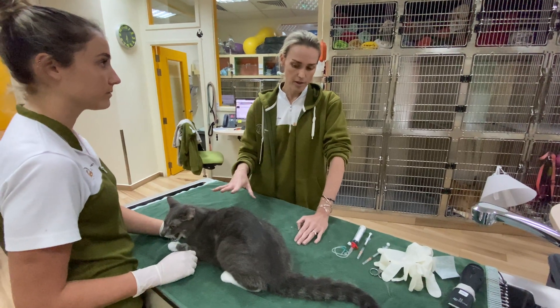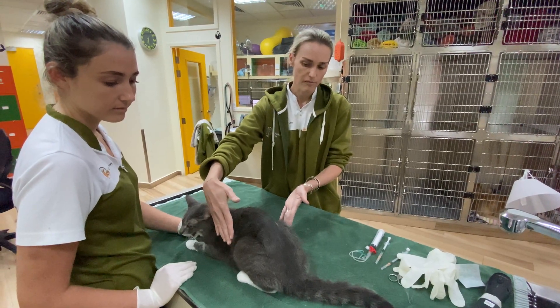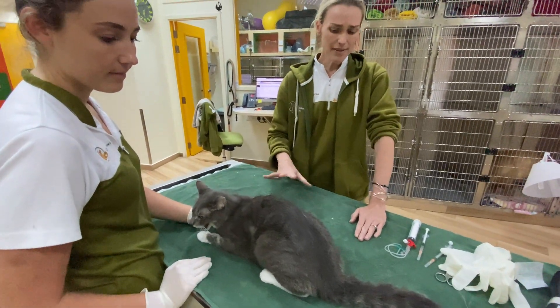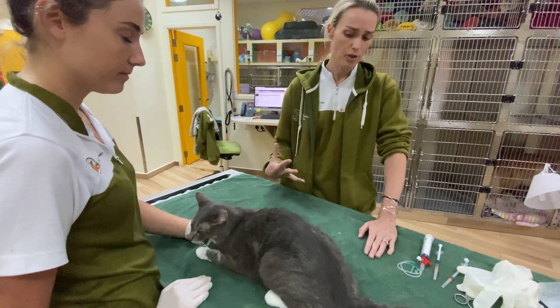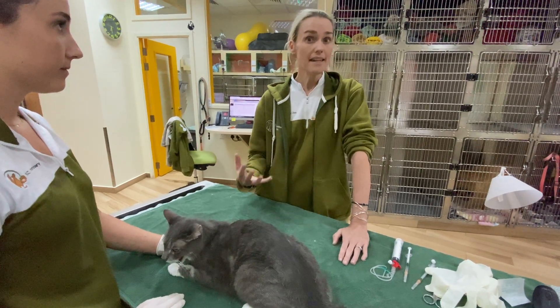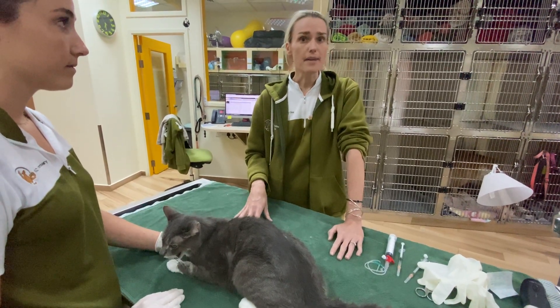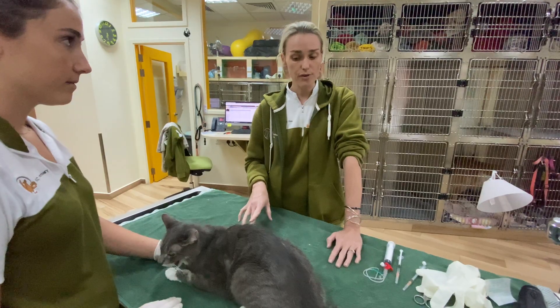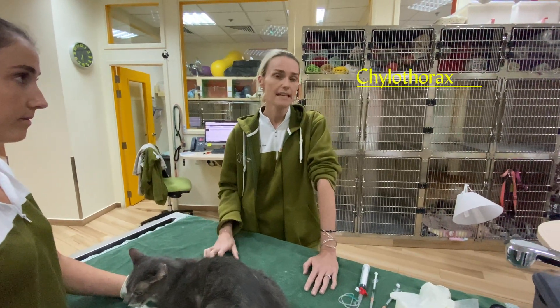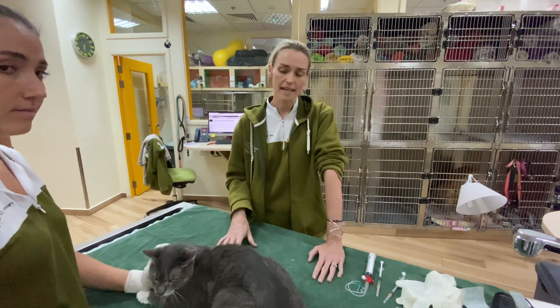Now in Puma's case, you can see Puma is actually what we call abdominal breathing — he's got very quick breaths coming a little bit more from his tummy, which is a typical situation when a patient is not coping well. He's been on oxygen and he's a regular patient who comes every couple of weeks to drain his chest, because he has a heart condition that puts pressure on his lymph vessels. He has what we call chylothorax, a specific type of liquid that we remove from the chest that unfortunately doesn't go away with certain heart medications, so we know we have to drain him on a regular basis.